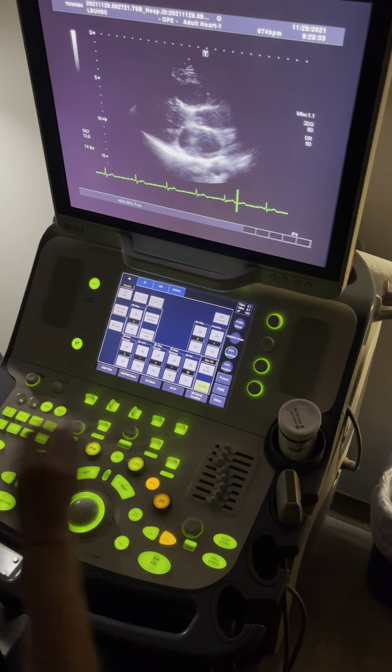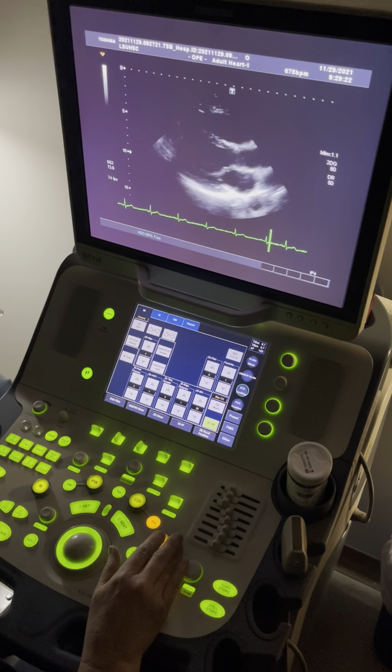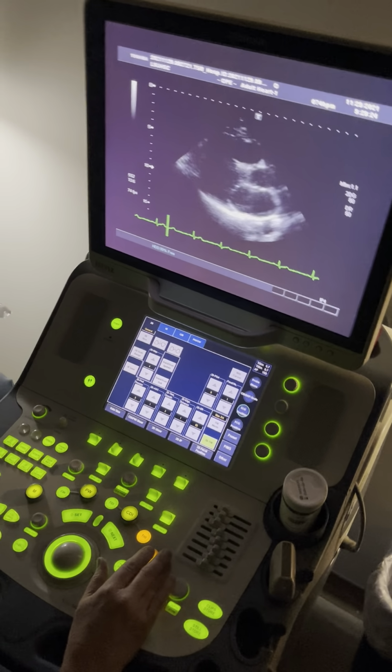Okay, I just need to make a comment. You might be scanning on a machine like this. Oh no. Okay, depends on where you get a job. UMC? No, UMC actually has older versions of a GE, but the older versions of GE look like the older versions of a Canon. Are you going to UMC? Yeah. Let us know how it is. Okay, I was planning on it.